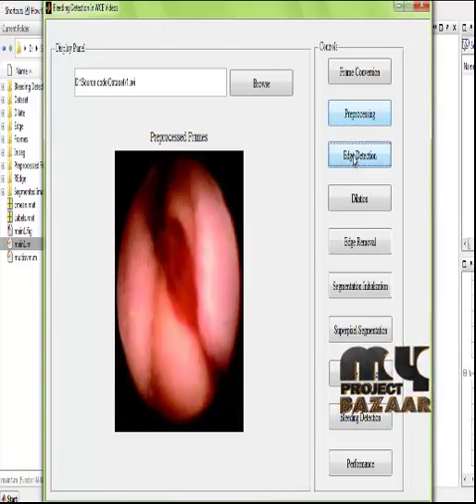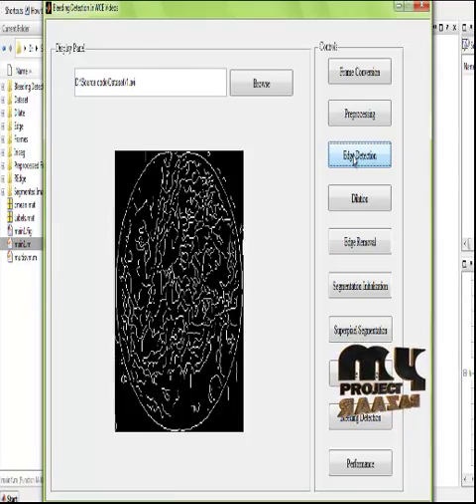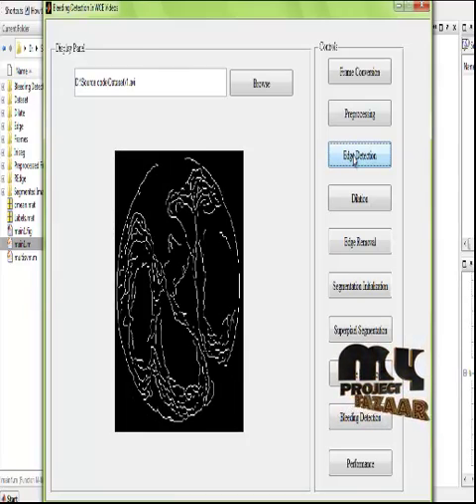After that, the edge regions in the videos are detected using the Canny edge detection operator. In this process, the regions in the images that contain the edges of interest are identified, and based on this, the identified pixels are selected for further processing.